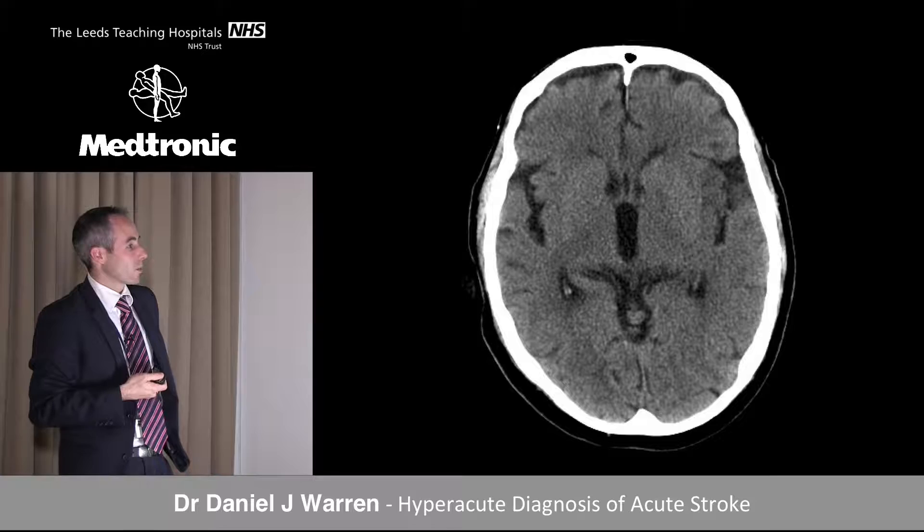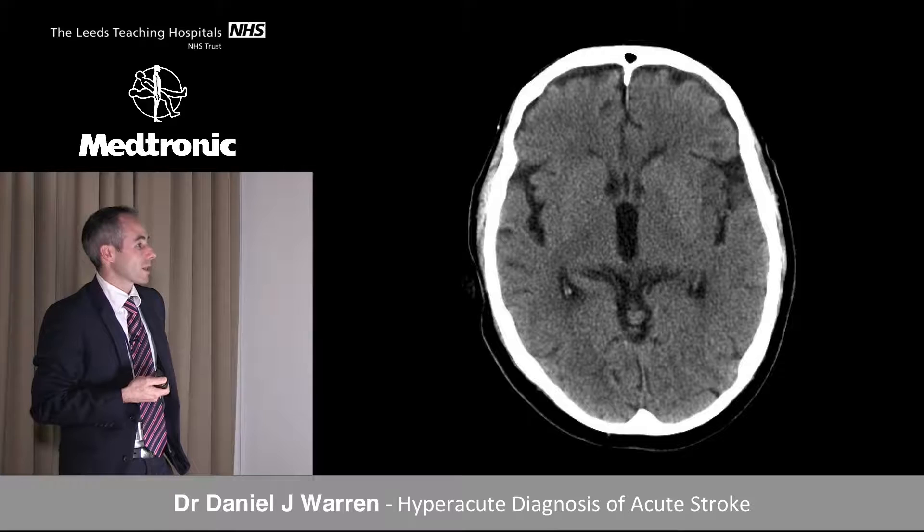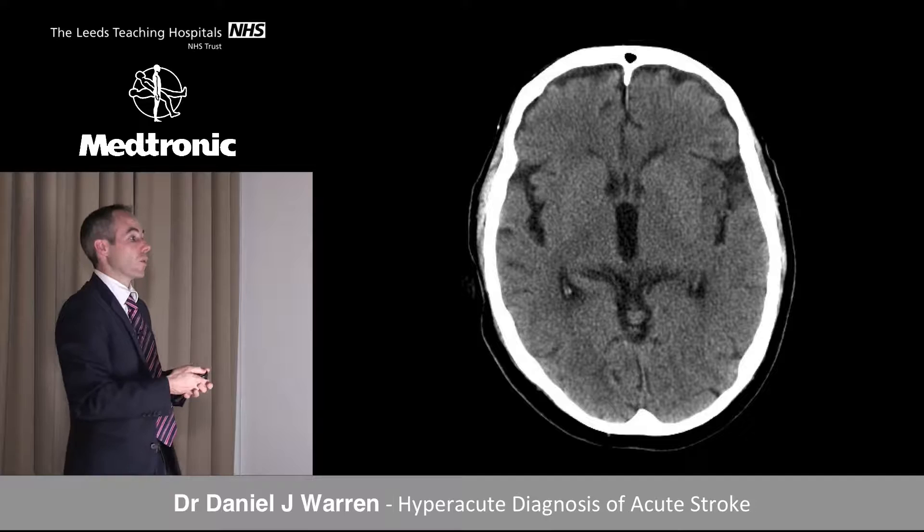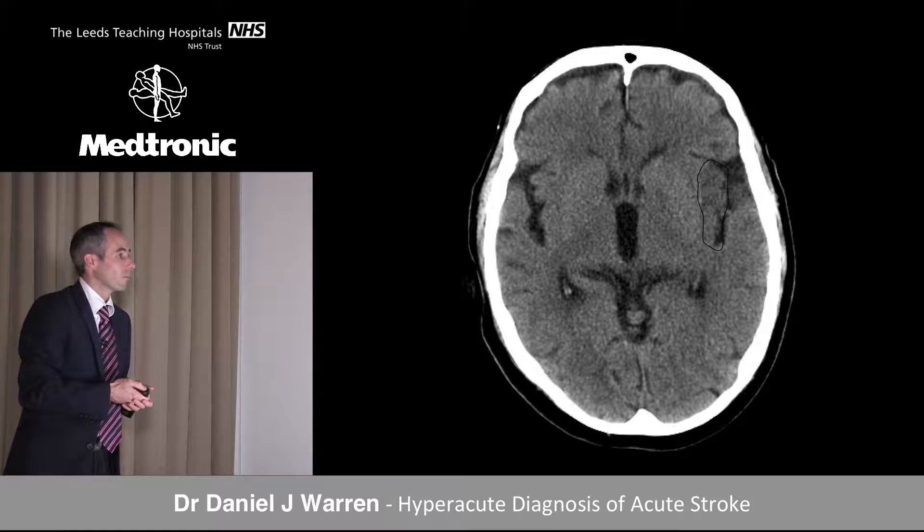Here we can see the caudate and the lenticular nucleus. Coming laterally we reach the insular cortex. The good thing about neuroimaging is there's often a comparator — comparing to the other side, we can see bright cortex on the normal side. Here it's lost. This is the insular ribbon sign.